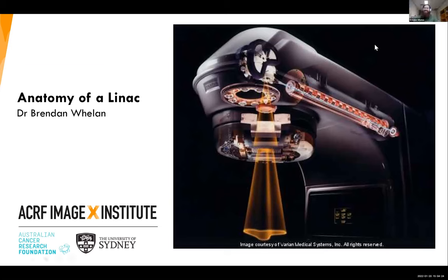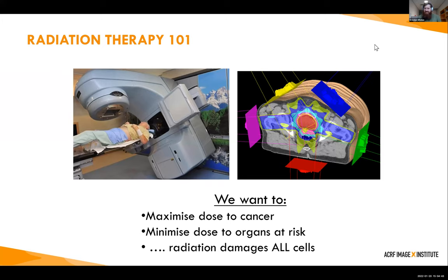Thank you for having me. Today I'm going to be speaking about this ambitiously titled talk, 'Anatomy of a Linac.' What I'm really going to be talking about is how we produce a megavoltage treatment beam. Just to get us on the same page, let's take a step back and recap what radiotherapy is and what we're trying to achieve.